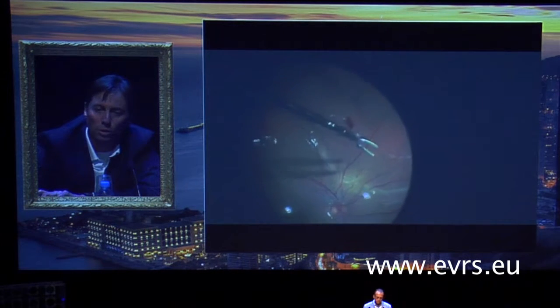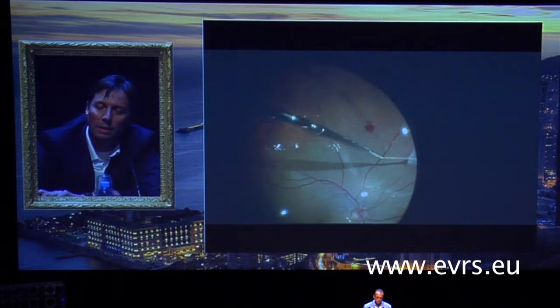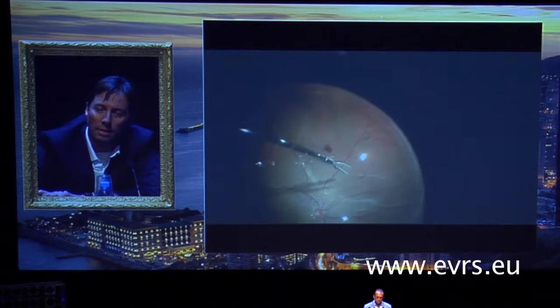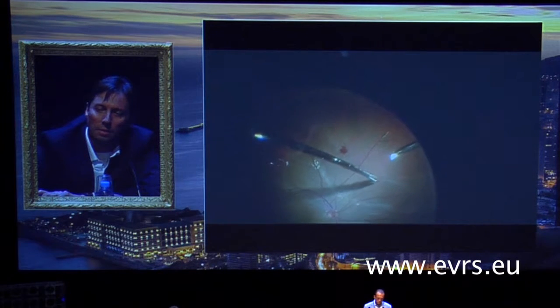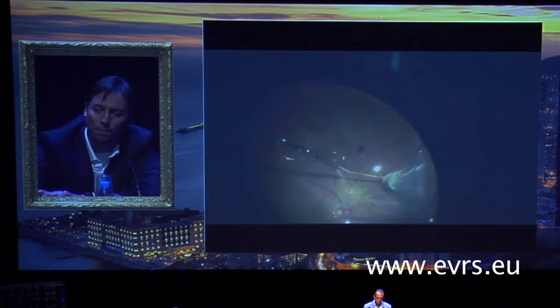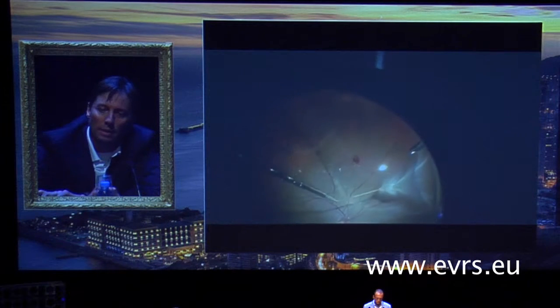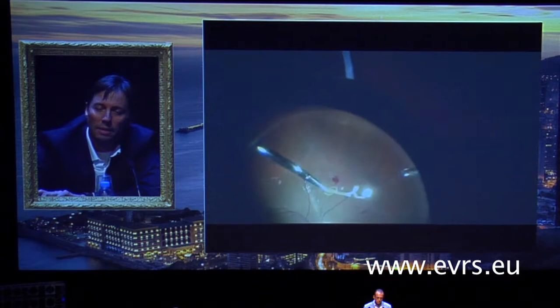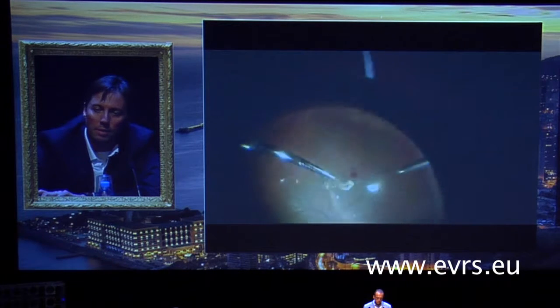And you can switch instruments. Maybe a serrated one is stronger for that step, but at the same time the movements are very delicate, and you try to get the thing at least in one piece. So the PFO gives you a secure retina. It keeps it there and helps you to get the strand, the subretinal PVR.